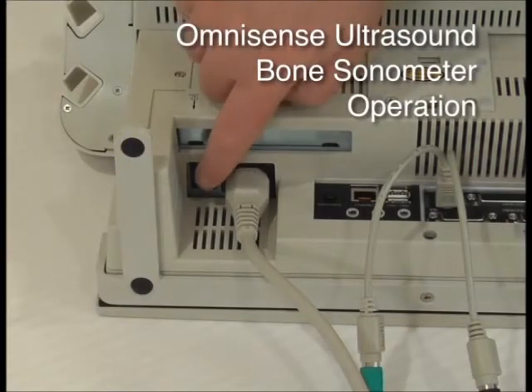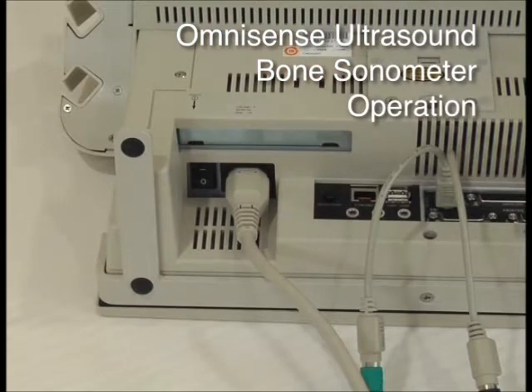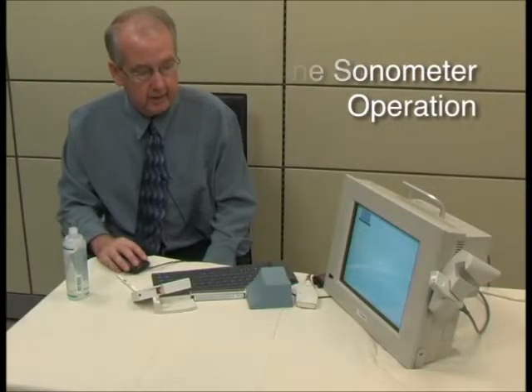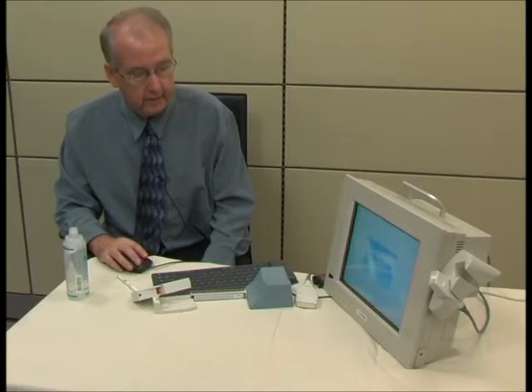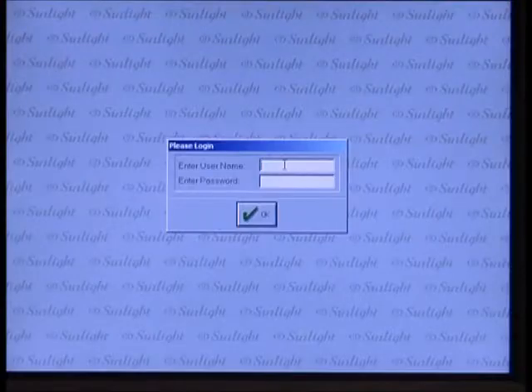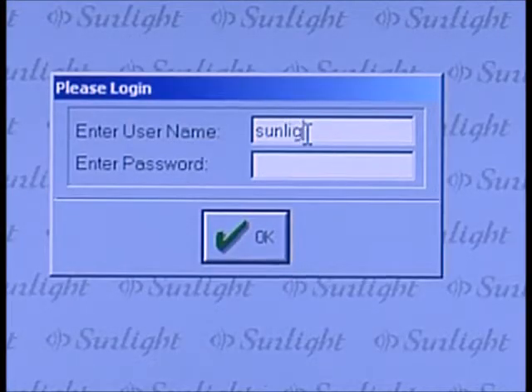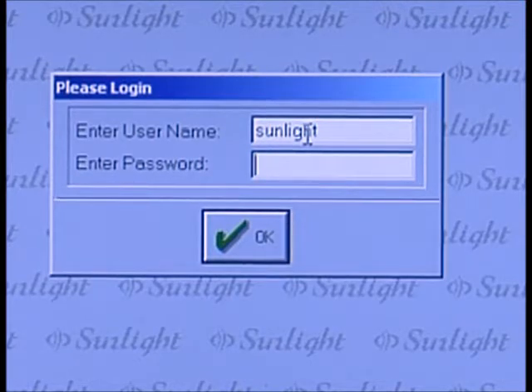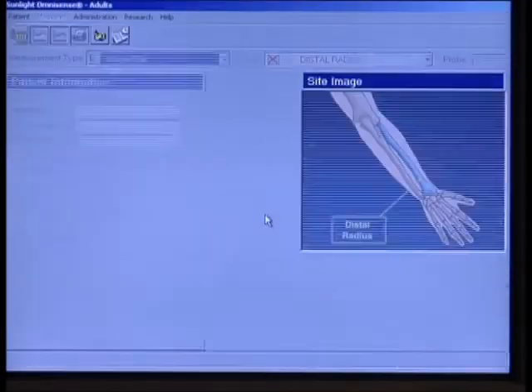We've powered on the unit from the on-off switch, which is at the back left of the unit, and this is the first screen we see. You'll see the OmniSense icon here. I'm going to click on that and we'll be taken to a login screen. The username from your user's manual is Sunlight — S-U-N-L-I-G-H-T — and the password is Omni — O-M-N-I. We'll click OK and we're taken right to the desktop.